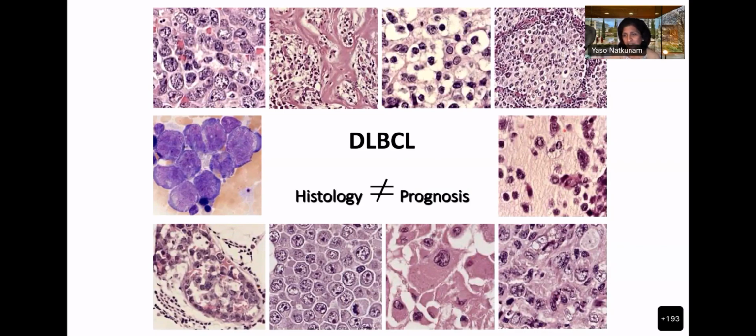At first glance, almost nobody would call this a diffuse large B-cell lymphoma. It looks like something that's neural. Same thing here, right? Extreme pleomorphism. It can present within vessels, as intravascular large B-cell lymphoma. It can look very ugly in an aspirate from the bone marrow, right? And there are almost signet ring cells, so it can actually overlap with adenocarcinoma-like cytology. So lots of different faces.